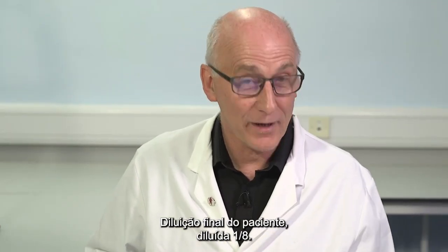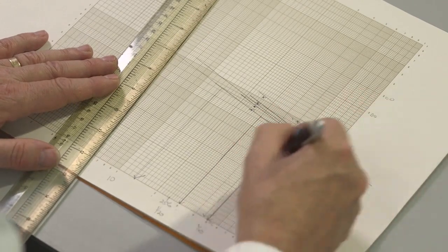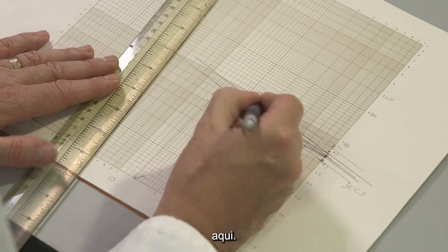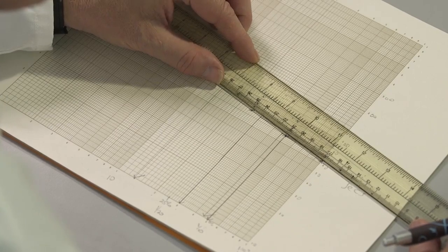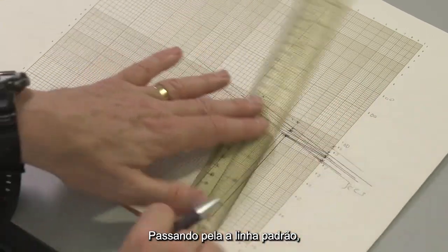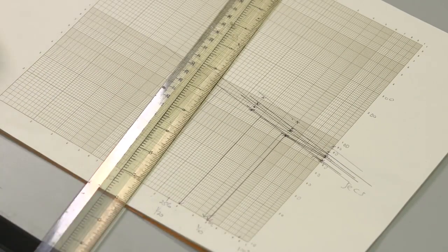Final patient dilution, diluted 1:8. Clotting times, 65, 72, 78, 78.5 here. Line of best fit. Across to the standard line. Drop a perpendicular. It's around 85, 86% residual.